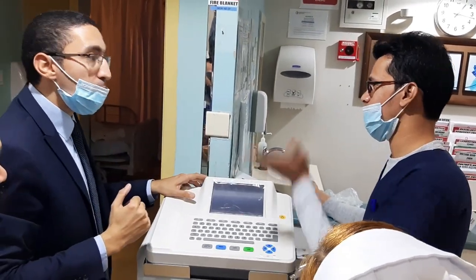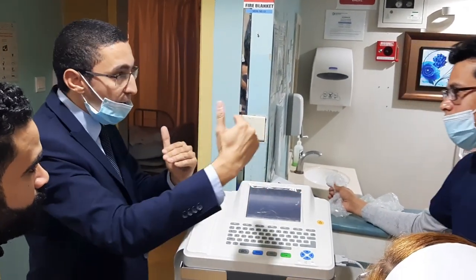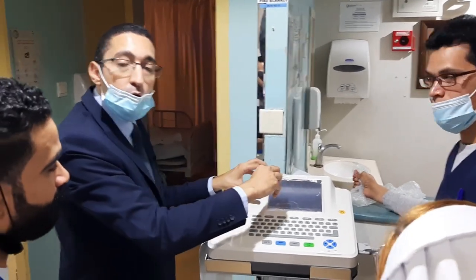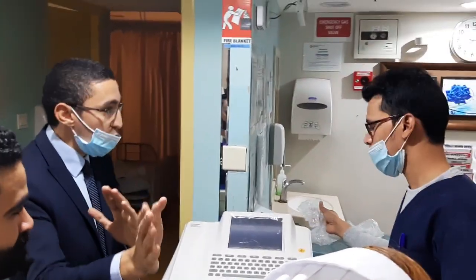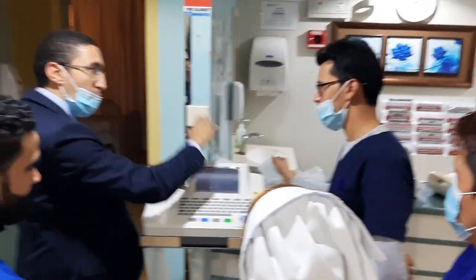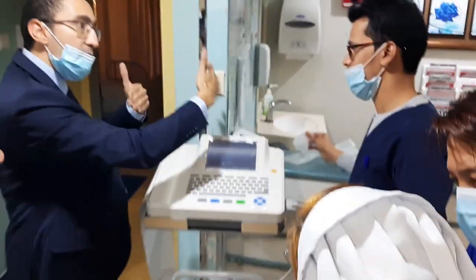In case next year the same patient will be coming to our hospital, we need the same copy. What will you do? So make a database and make a hard disk file. Maybe, if you need, we can insert the USB, then check and print. Yes, you are right. And keep it as a database with the engineer or computer here. Once the memory is full, take all that and go to the computer. Again, it will be safe.